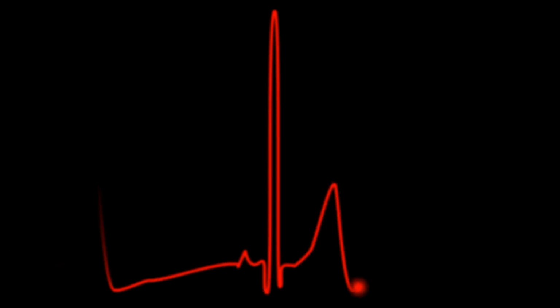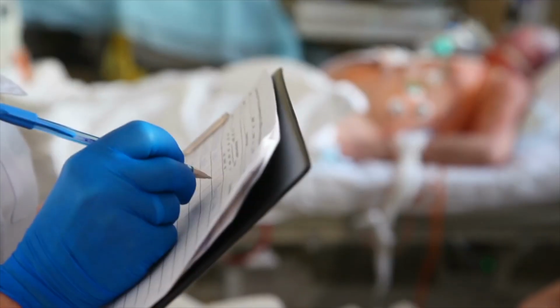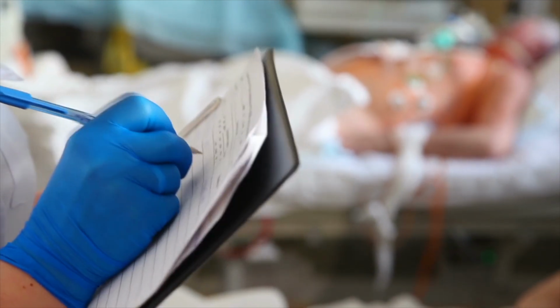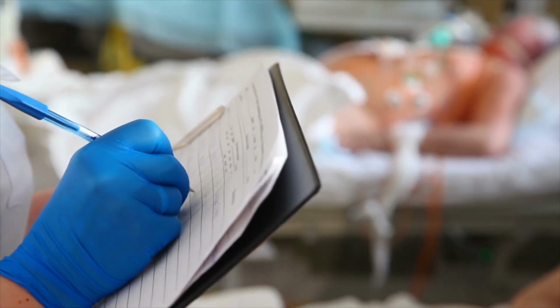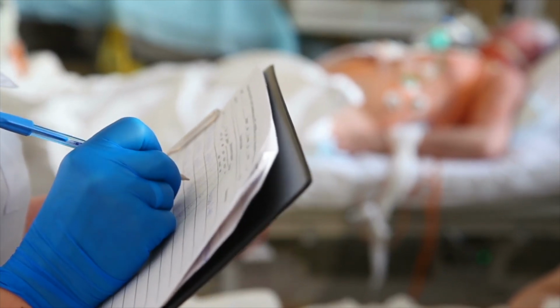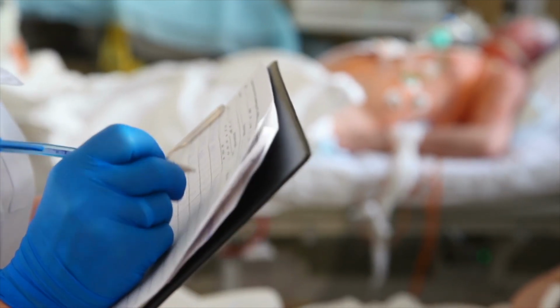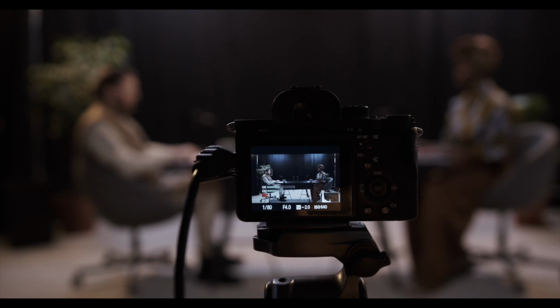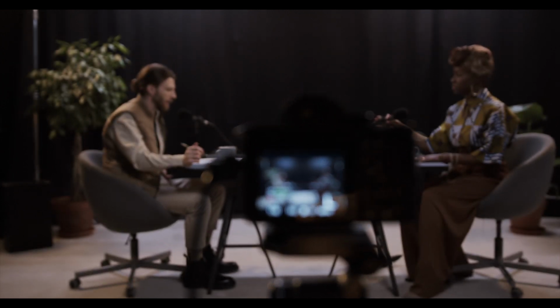Think of the ECG as a map of your heart's electrical activity. A map. Okay, I'm listening. Every map needs a standard scale and orientation, right? That's where calibration comes in. Dr. Barai stresses how important it is that every ECG machine is speaking the same language, so to speak. So no matter where you go, the ECG is telling the same story. No lost in translation issues. Precisely, because a misplaced landmark on a map can throw you off course, right? Well, a miscalibrated ECG could lead to a misdiagnosis, and we definitely don't want that.